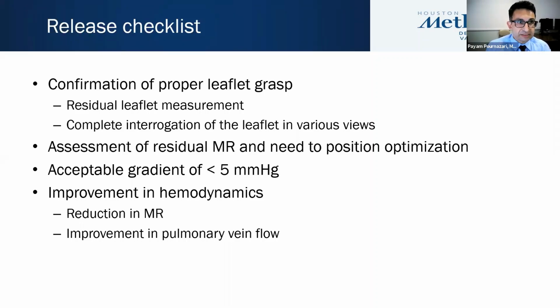After the clip is in place, there is a release checklist, which requires confirmation of proper leaflet grasp. The proper leaflet grasp has to be done in multiple views to make sure that the posterior and anterior leaflets of the mitral valve are grasped and tucked in properly in the clip arms. And it requires a complete interrogation with color in various views as well. Assessment of residual mitral regurgitation and potential need for optimization.